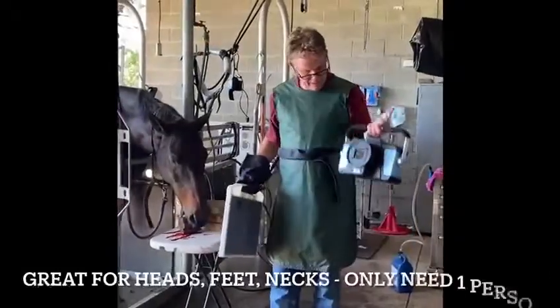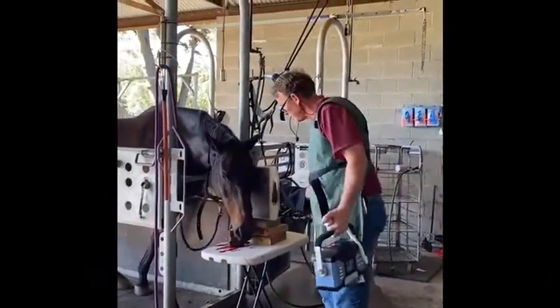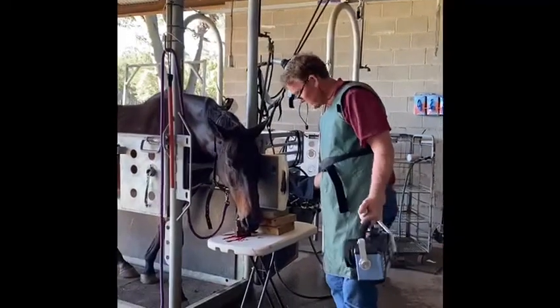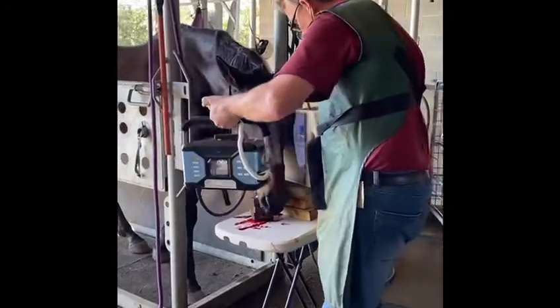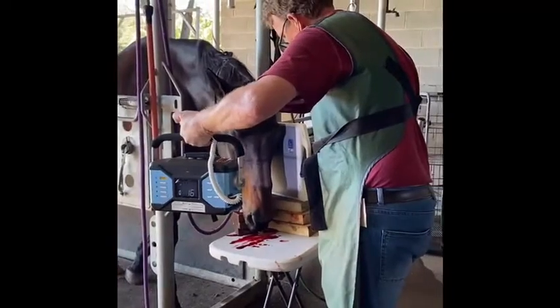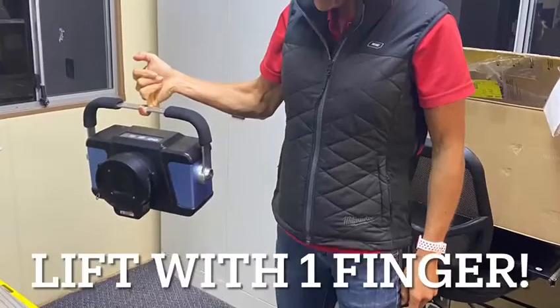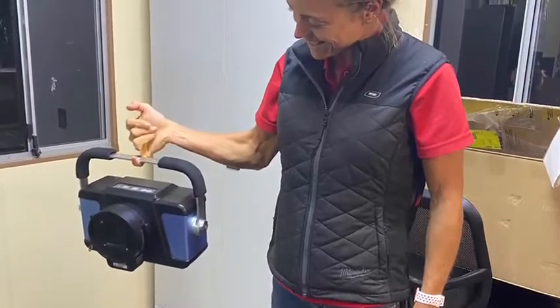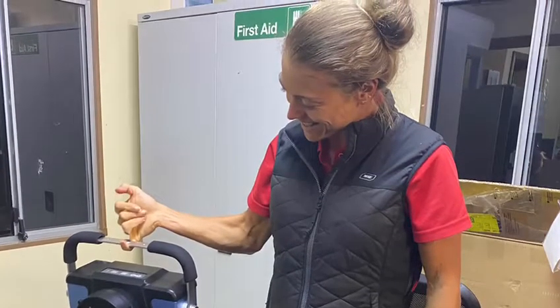This is showing how with the lightness of the POSCOM Airaid machine it's easy to do x-rays where you're the only person near the patient. You can do a double click, the light will come on, hold it back there, and take the shot on a breath.